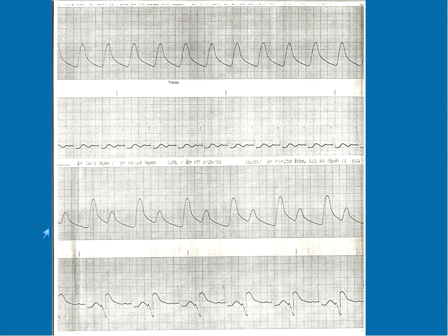Now what's cool about this slide is here is bigeminy. So this is the normal QRS, and I know you can't see that very well, and here's the early beat. And here's the normal beat, and here's the early beat, and here's the normal beat, and here's the early beat.